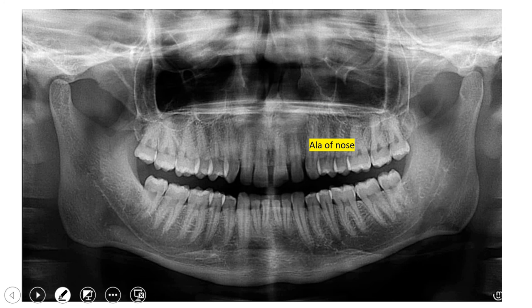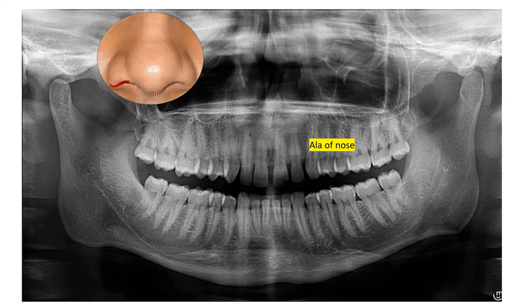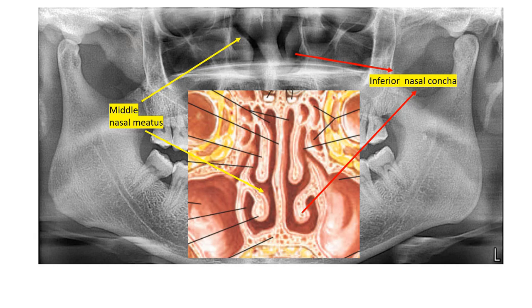The next structure that can be visualized in the radiograph is the ala of nose. A faint shadow can be seen at the center — that is the ala of nose. This is the ala of nose. The other nasal structures evident are: this is the inferior nasal concha on both sides, this is the nasal septum, and here you can see the middle nasal meatus — the space above the nasal concha is the middle meatus.